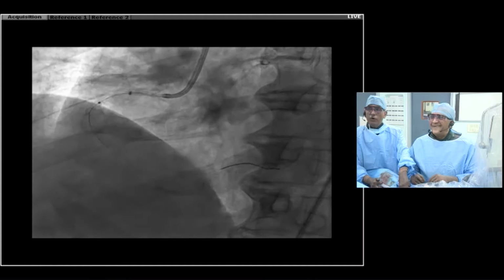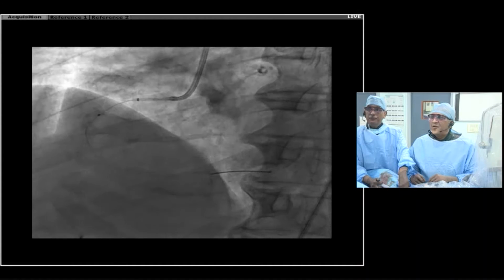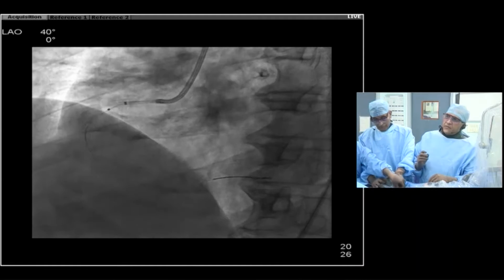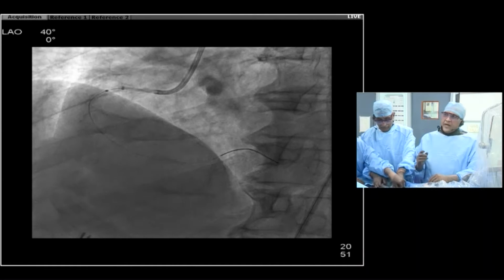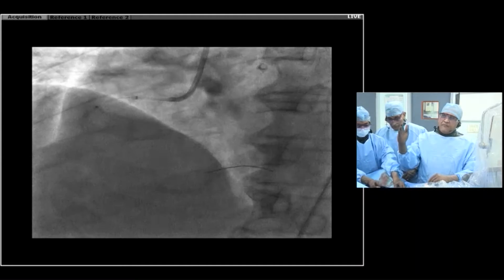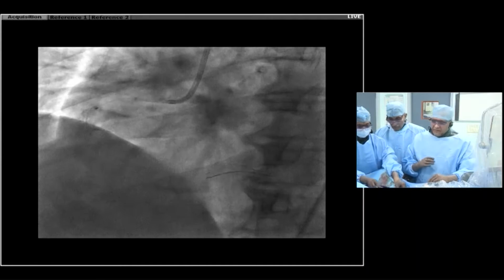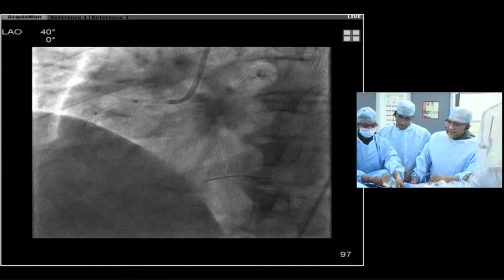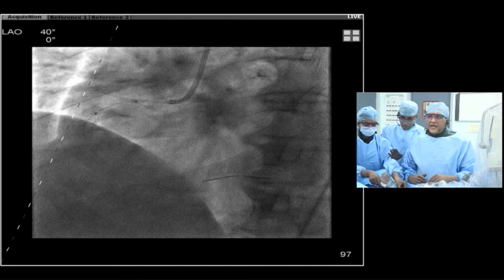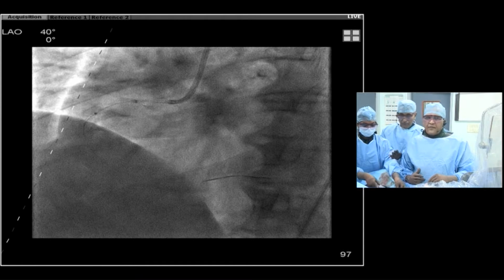It's 0.9. It is 0.9. You usually see that I'm going extremely slowly, and what we don't do in laser anymore is come back. We don't pull the laser catheter back. We go and stop where we've gone and let it be. That helps us much more. And so that was your first run. At 80-80, the 0.9 allows us a 10-second run with a 5-second break.